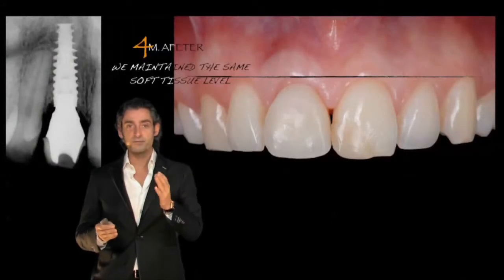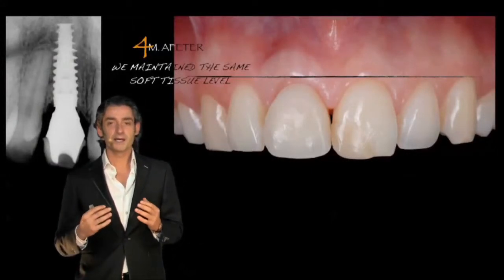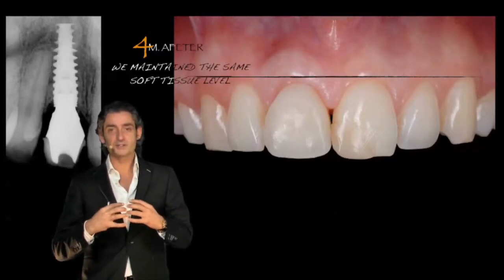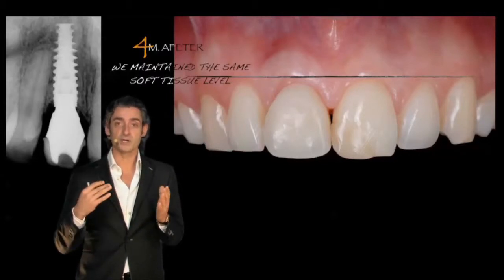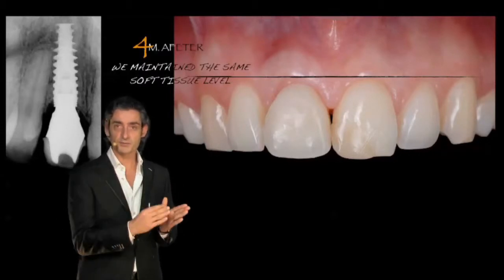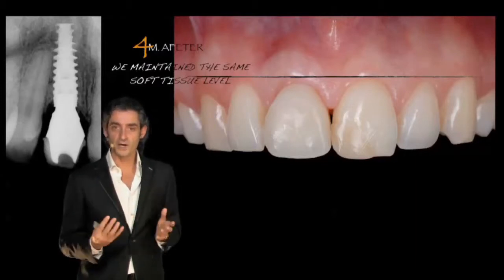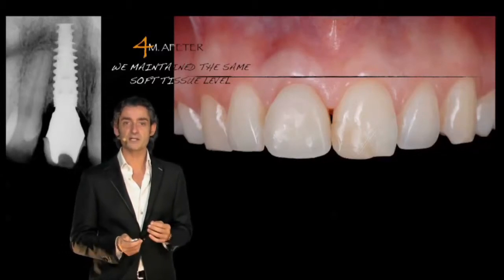And look at here. Right now, it's really important to see 4 months later. Right now, we are in a good condition here. Probably the tissue in the buccal side is too bulky. It's too much. But for me, it's a really nice condition to start from. Because with this provisional restoration, I will try to push the margin a little bit just to improve the free gingival margin compared to the other central incisor.